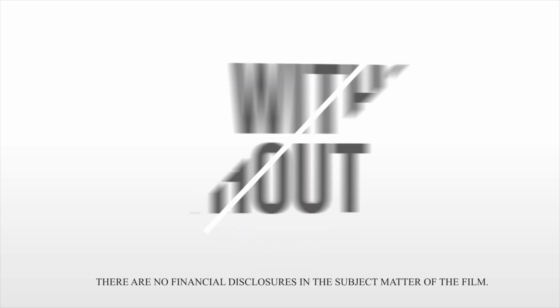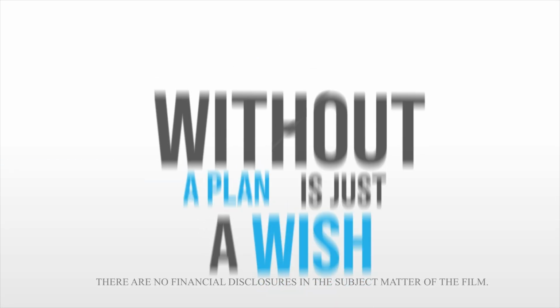A goal without a plan is just a wish. Considering that I wish to have a seamless experience with phacoemulsification every single time, what I really do is not just have a plan A, but I have a plan B and a plan C.